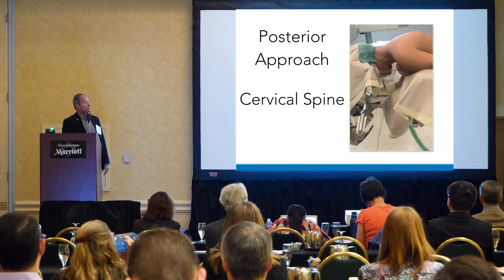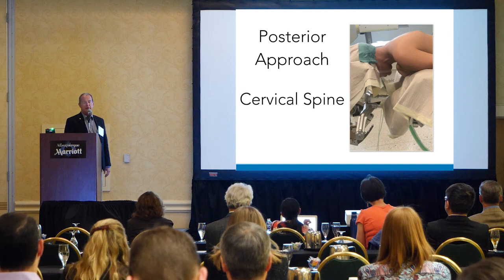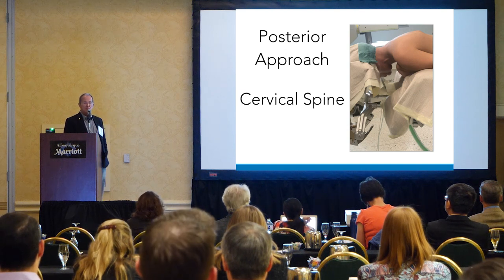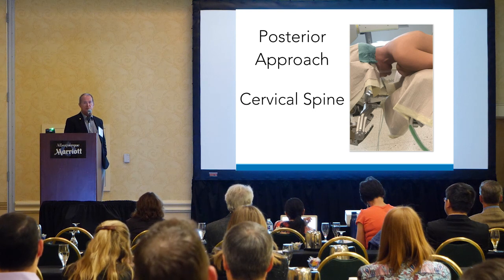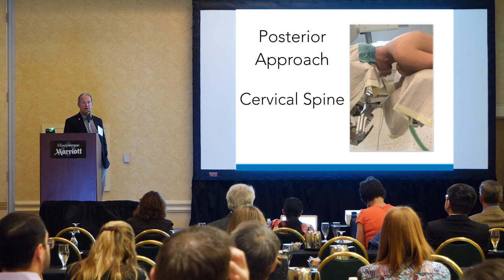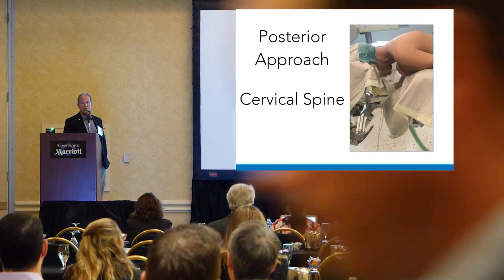What I use is just a flat table. I put a roll underneath the chest, just about where that corner of the table is located, enough to flex their head forward, and then I tape using 3-inch silk tape or one of the adhesive tapes that doesn't stretch. I'll go down and pull their shoulders down as much as I can. I always thought, geez, am I pulling too hard? But I've never had any problems with pulling their shoulders down.